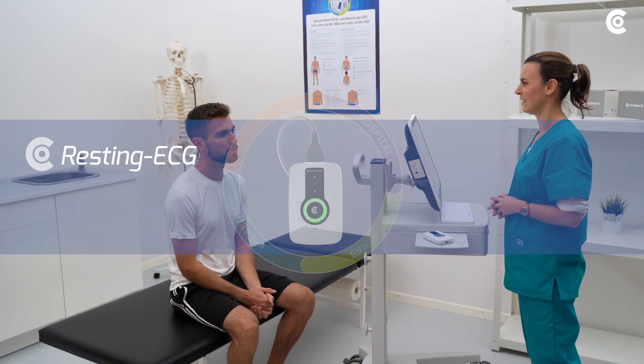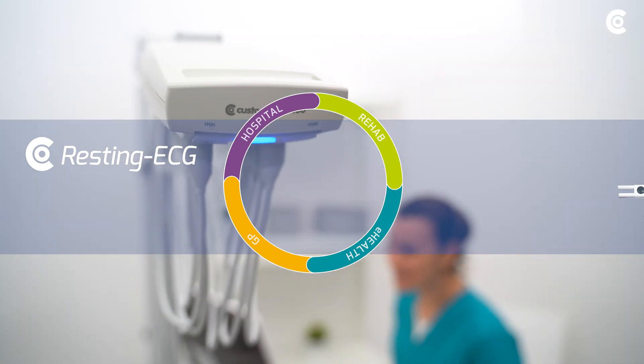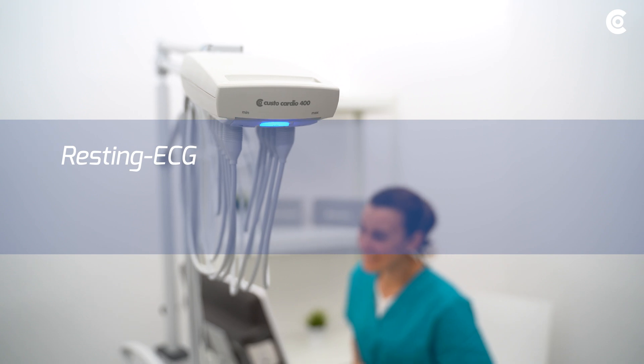In the following video, I will explain the performance of arresting ECG with CustoCardio 400 and CustoCardio 300.